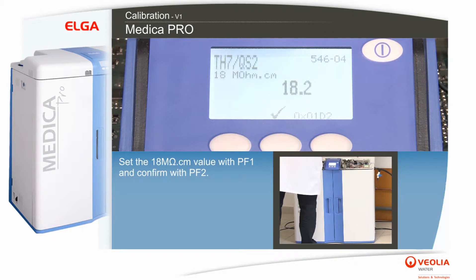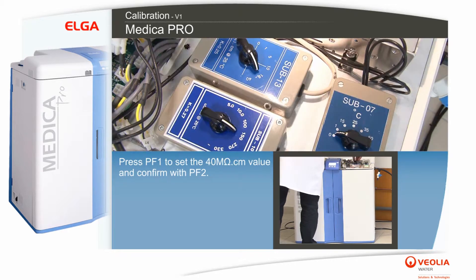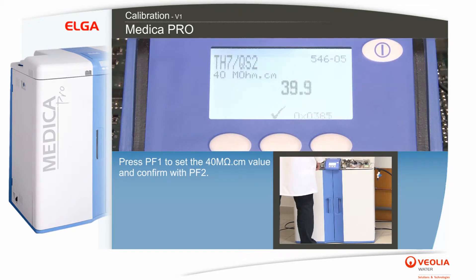Set the 18 megaohm centimeter value with PF1 and confirm with PF2. Press PF1 to set the 40 megaohm centimeter value and confirm with PF2.